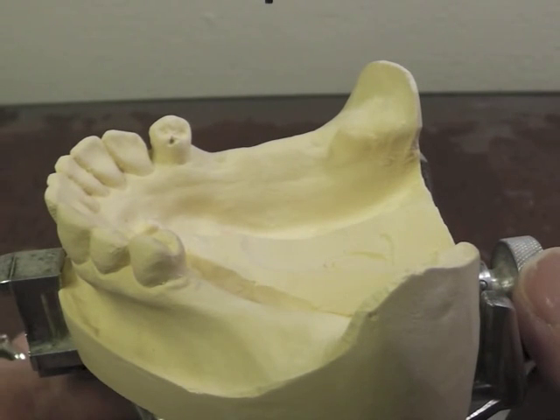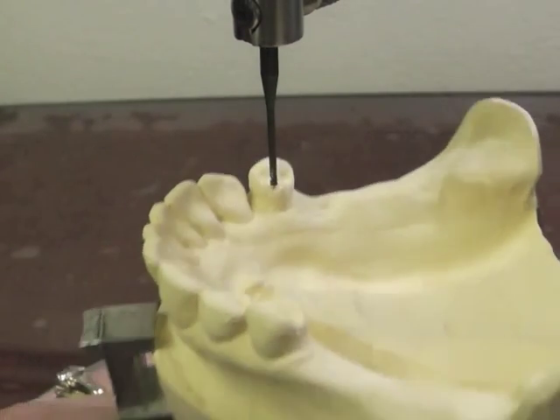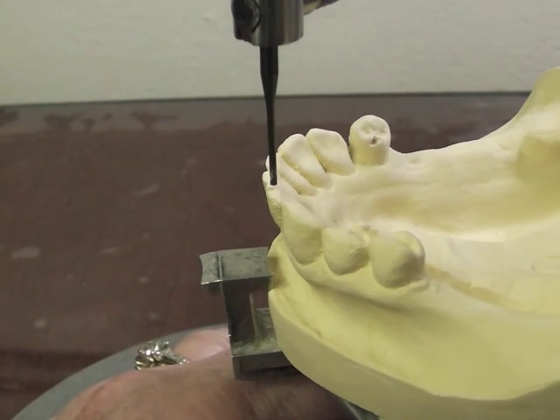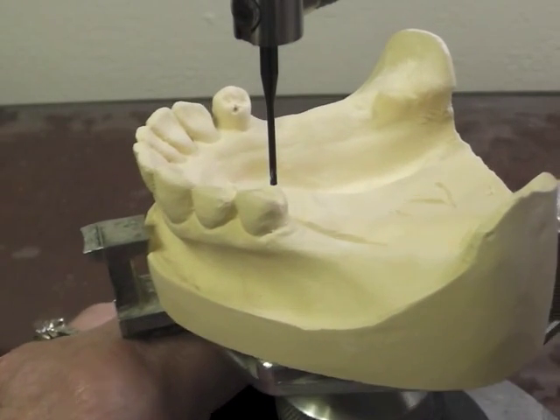We're going to go ahead and survey our cast. The first thing we do is pretty much line up the cast so that the occlusal plane is relatively parallel to the floor and all the abutments are at about the same level.